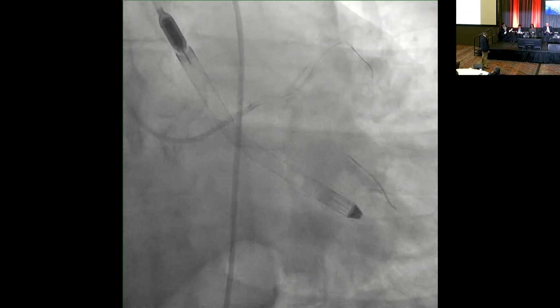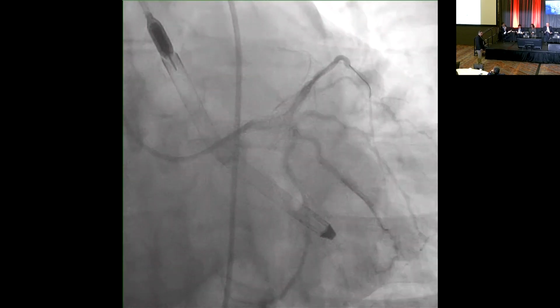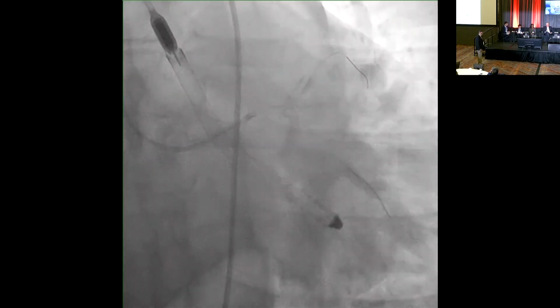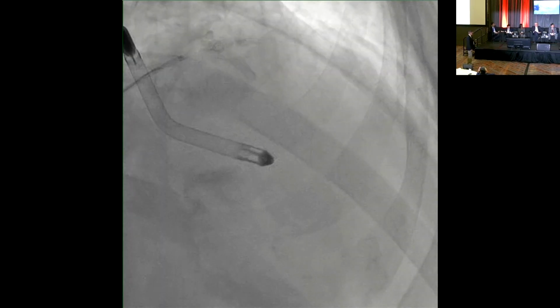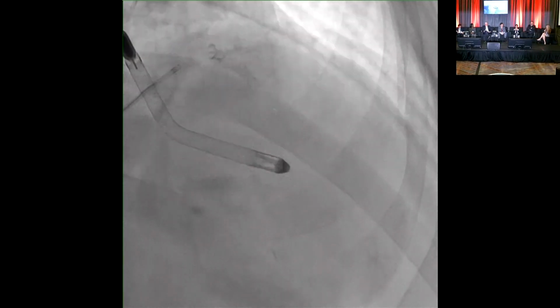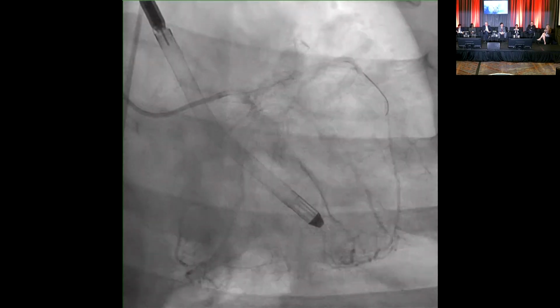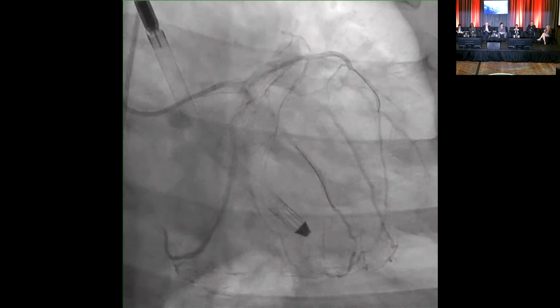So just throwing it to the panel, anything you would have done different here? Obviously, it's very low contrast, a lot of intravascular imaging, two-stent technique. I mean, and Rhian, any other thoughts? That was an excellent result to that case. And I think these are excellent cases to showcase that you can get away with very minimal contrast, but learning to do minimal contrast PCI, this case would be very challenging, but do that in your standard PCI cases and get comfortable with just IVUS running, marking it. These are all great things to learn, particularly as an early career.